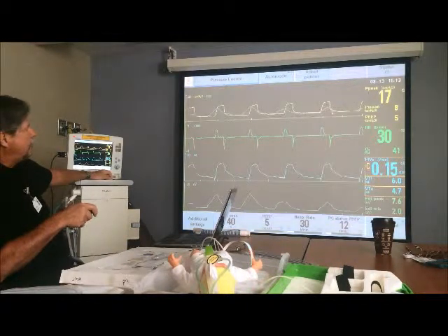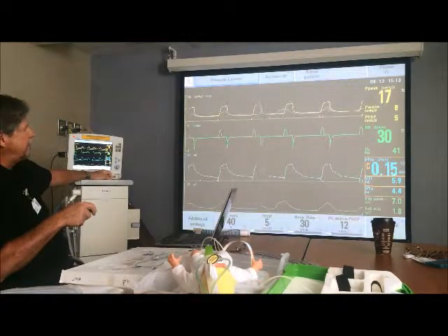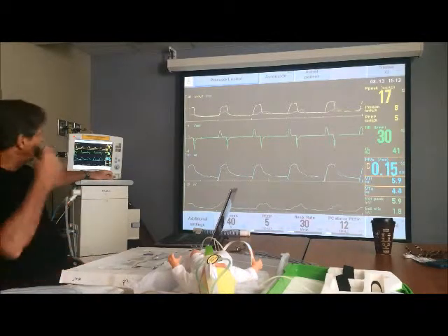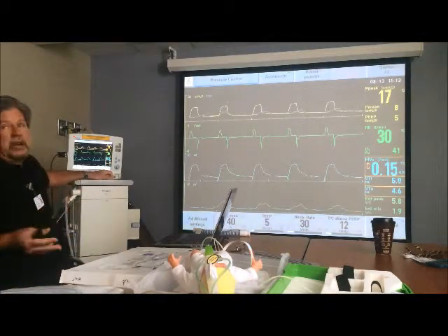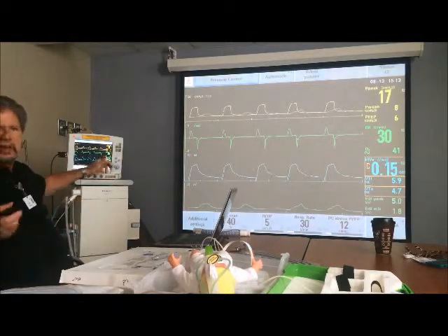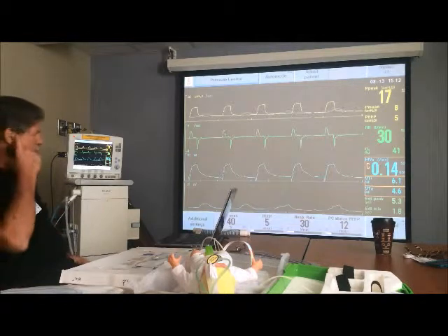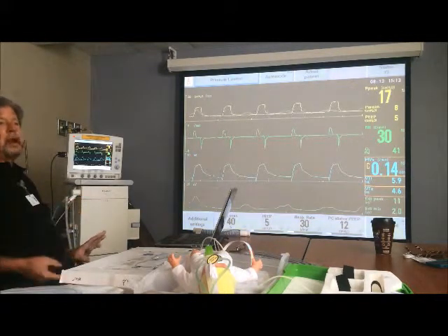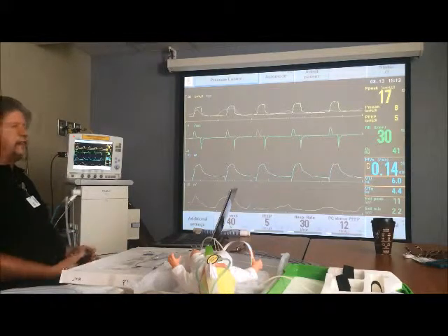There's that one. That one would be kind of a perfect one in that sense, right? The EDI was right there and the ventilator fired, but no, we're still not looking very good in terms of synchrony. And you could even go to another mode. You can just experimentally say, well, let's put them in pressure support for a minute and see if that helps. But the point is, you're using this simply as a monitor to try to improve how you set the ventilator.